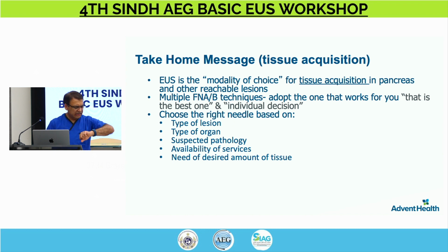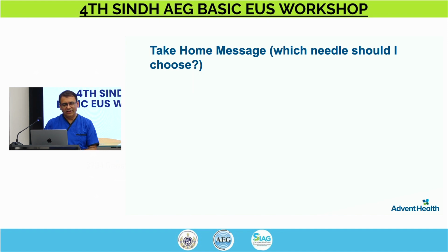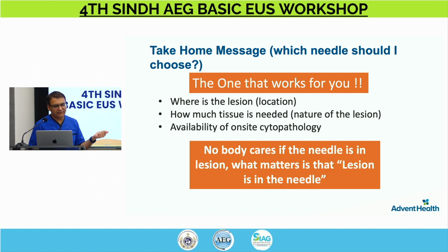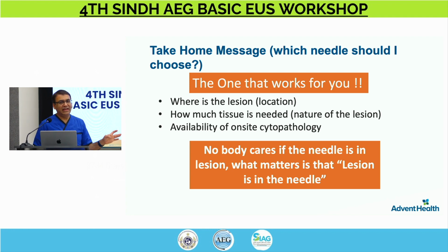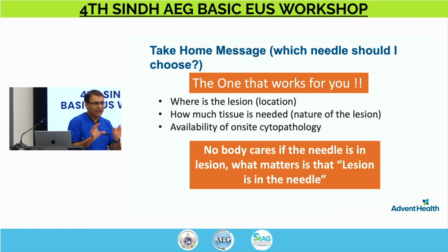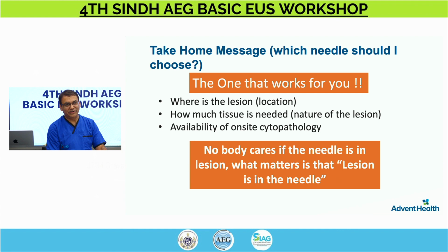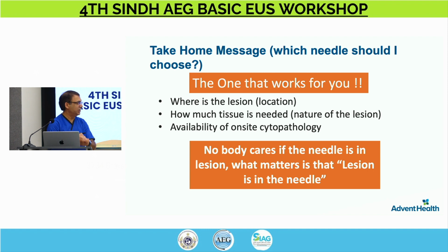Take-home message, I think that's enough. And the biggest take-home message is, which needle should I use? I keep saying that. What works for you? And the other thing is, really nobody cares. You can keep saying my needle is in the lesion. They don't care unless the lesion is in the needle. That's the whole point, that's really the gist of it. You need to have the lesion in the needle, and whichever needle works for them.